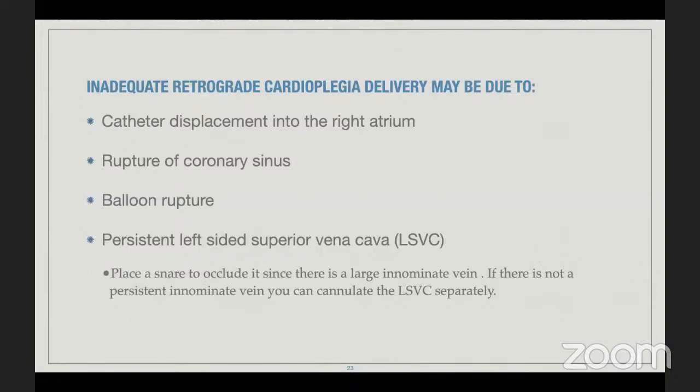Normally, people always say, well, I'm going to open the aorta and just do ostial cardioplegia, which is the way to go. But if you just lift the heart a little bit, behind the main pulmonary you will see that big SVC, which is the left SVC. That's normally the answer, and they will take you to that route.